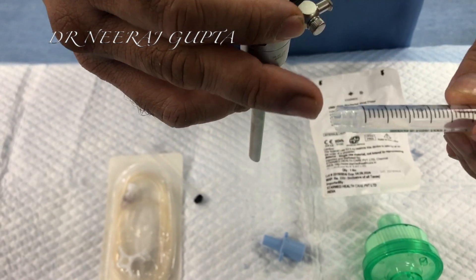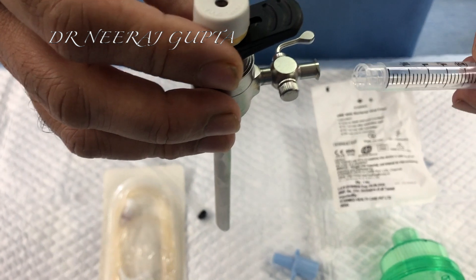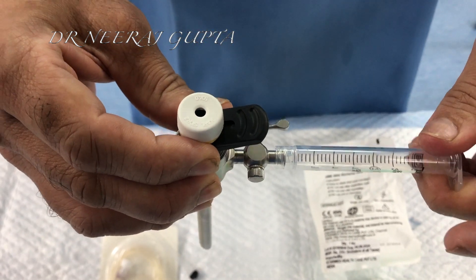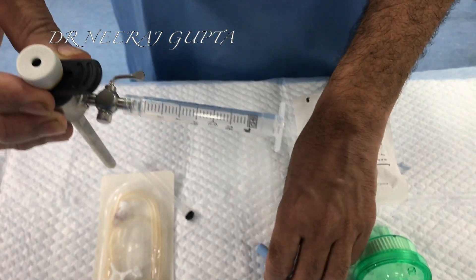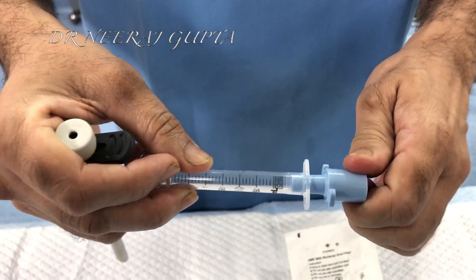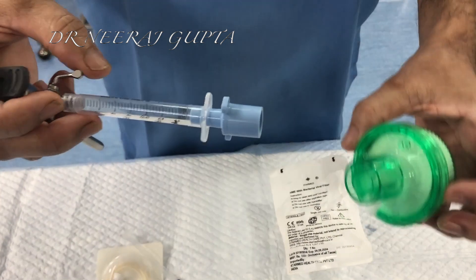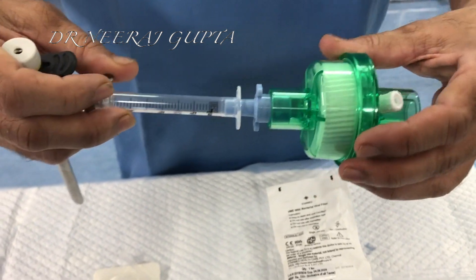This is a Luer lock syringe, 2 and 3 ml syringe with a Luer lock. It will fit nicely into the port outlet here, and we will put one which fits — it should fit absolutely nicely and tightly. And then we will fit it into the filter, the HME filter.